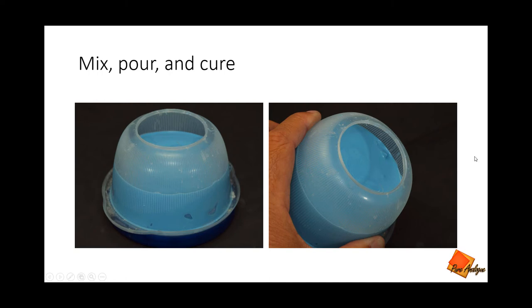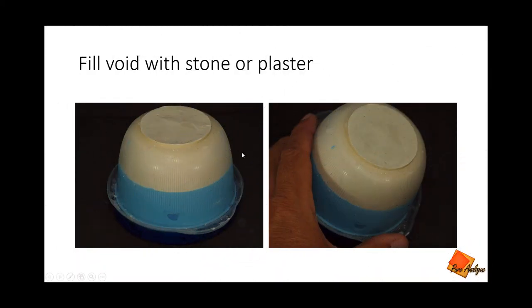What I'll do is take and pour in stone or plaster in the rest of the half. In other words, I'm void filling all of this area with just some cheap stone. It provides a rigid base for the silicone to be up against, and nothing's going to move when I go to deflask the model later.